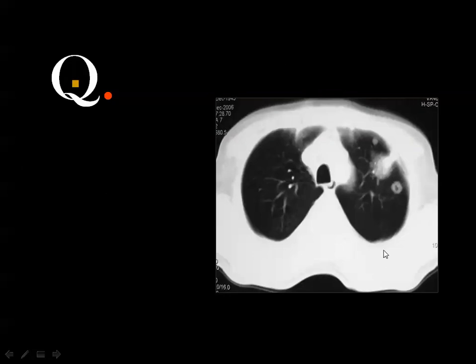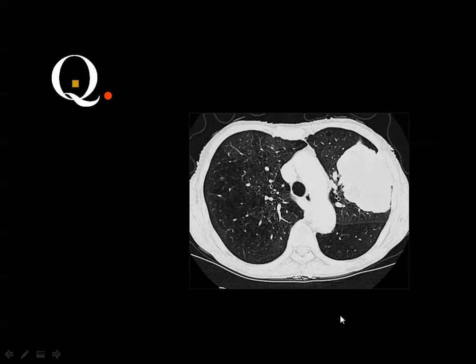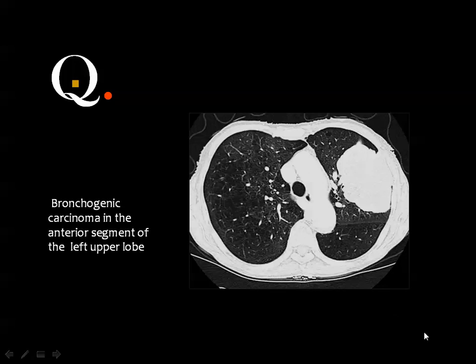Where the trachea is visible, you are cutting in the upper lobe. If you want to specify the segment: draw the dividing lines — this is the anterior segment of the left upper lobe. A mass in the upper lobe with the trachea present would be in the apical and partly anterior or apical-posterior segment of the upper lobe.